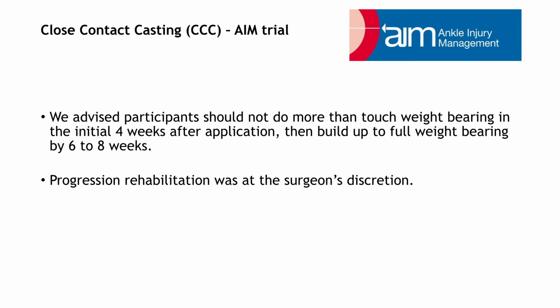Bob Hanley now discusses the method and demonstrates the application of close contact casting.